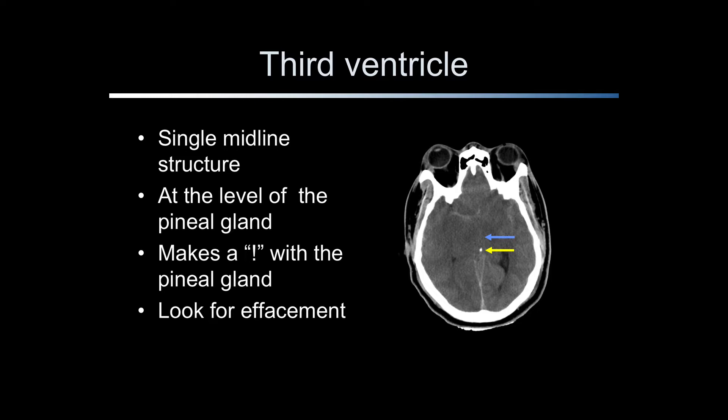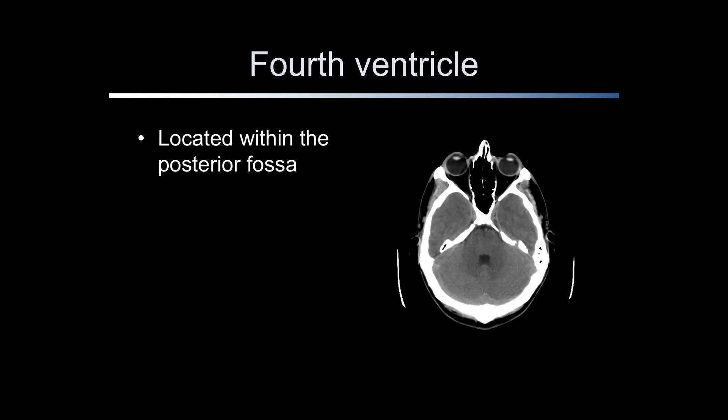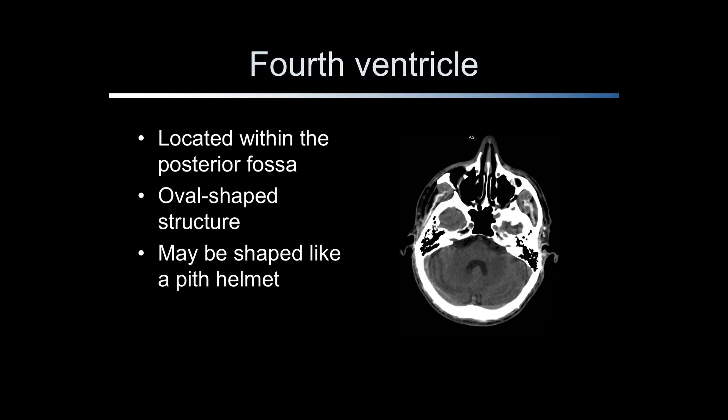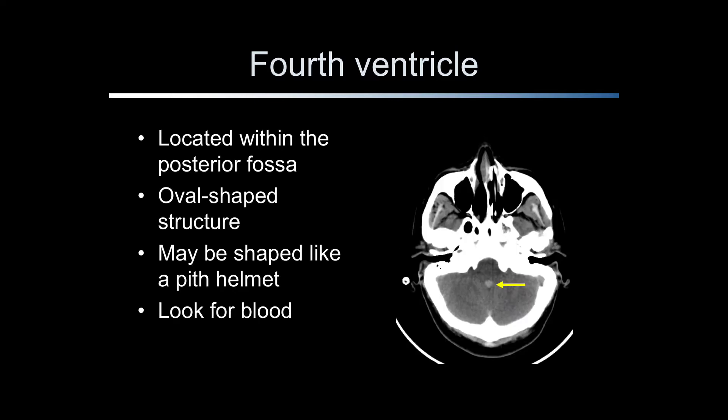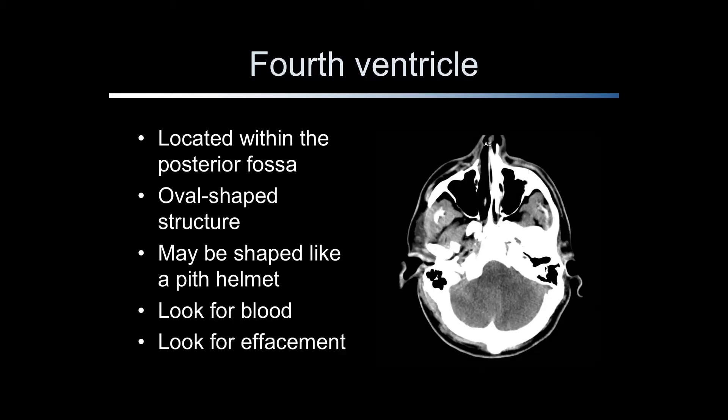The pineal gland, indicated by the yellow arrow, is typically just posterior to the third ventricle. The blue area points to the location where the third ventricle should be seen — it is effaced on this CT scan. The fourth ventricle is located below the tentorium in the posterior fossa. It is typically oval-shaped or may be shaped like a pith helmet. Blood in the fourth ventricle is rarely seen but is shown here by the arrow. Compression or effacement of the fourth ventricle occurs infrequently but is seen here as a result of severe trauma.